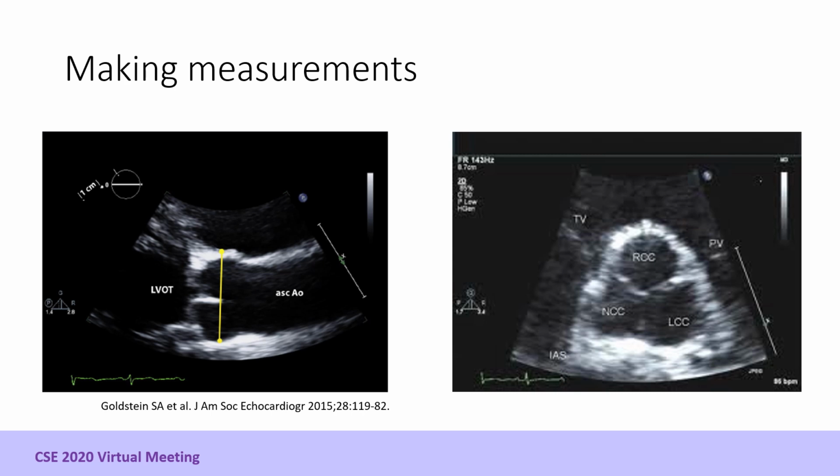The aortic root is very well seen on transthoracic echo and is measured in a zoomed-in parasternal long axis view as the largest diameter from the right sinus of Valsalva anteriorly to the posterior sinus, which is usually but not always the non-coronary sinus. It is measured at end diastole using the leading edge to leading edge technique. It is important to know that variations in probe angulation will cut the aortic root along different planes, and so it is important to actively search for the largest diameter. If the curvature of both sinuses is well seen and the line of aortic leaflet coaptation is midline, then this will likely represent the maximum obtainable measurement.